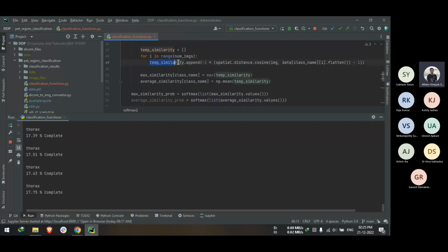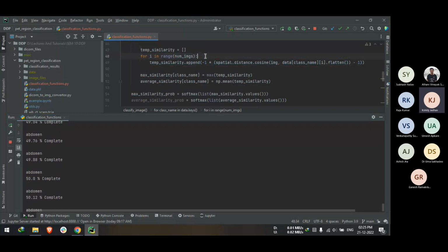So right now it uses cosine similarity, but we can train a CNN model as well. Cosine similarity is very modular. We don't require any training as such, and it works reasonably well. Could we also try, like we discussed in the morning, Dr. Venkat, if Atharva could also try with a small CNN and see if we have similar accuracy or not?